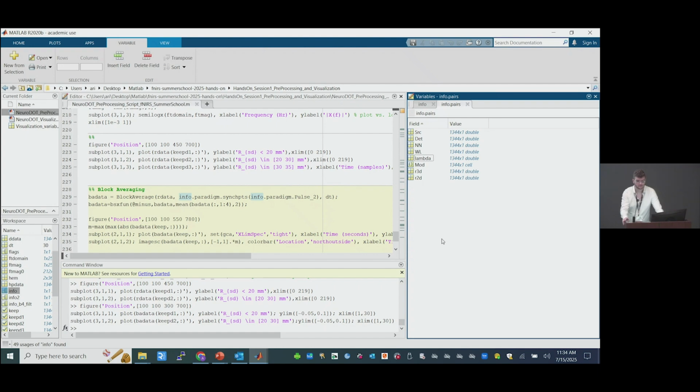That's an excellent question. So that is a feature that we have yet to incorporate. So we'll probably talk to Tom or Dennis or other frequency domain people to see if they have preferences on how that could be handled.